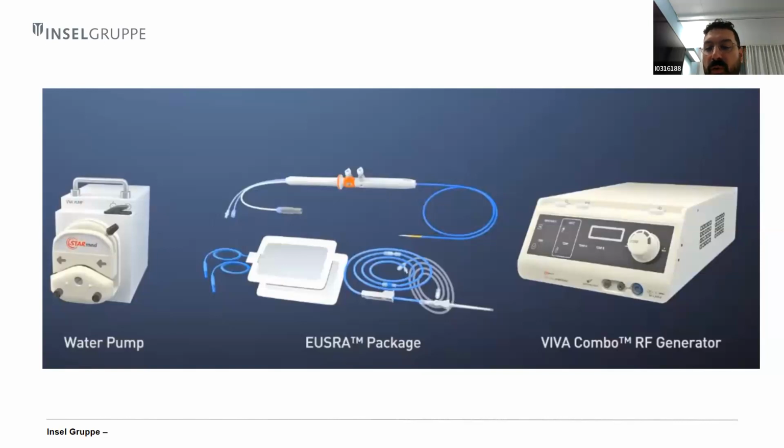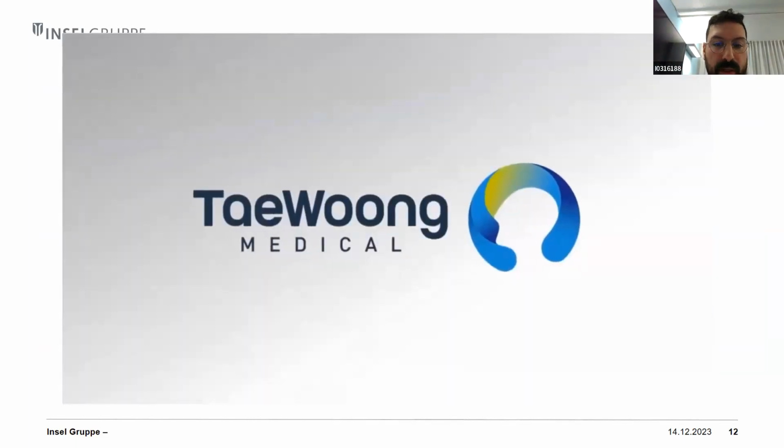This system also includes a water pump, which cools the electrode tip by circulating saline at a lower temperature to reduce tissue char. And here I would like to show you a very short video of how it is performed.